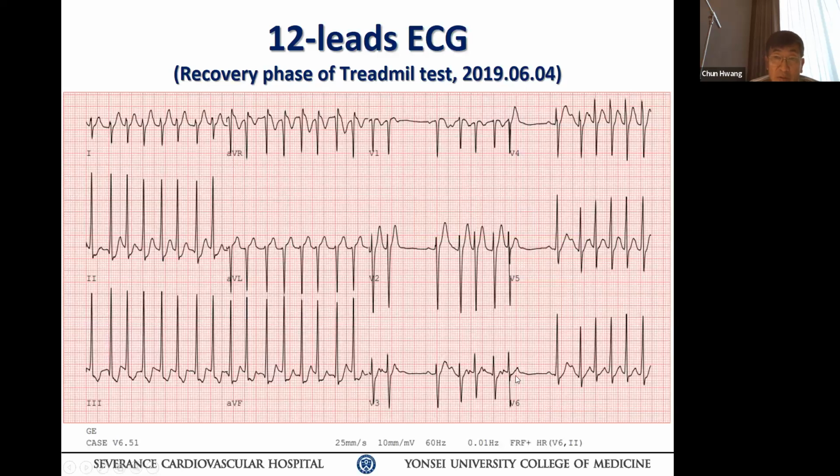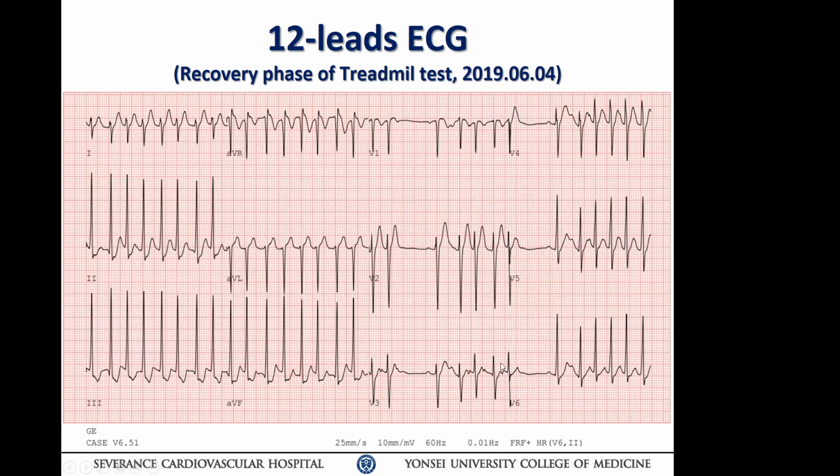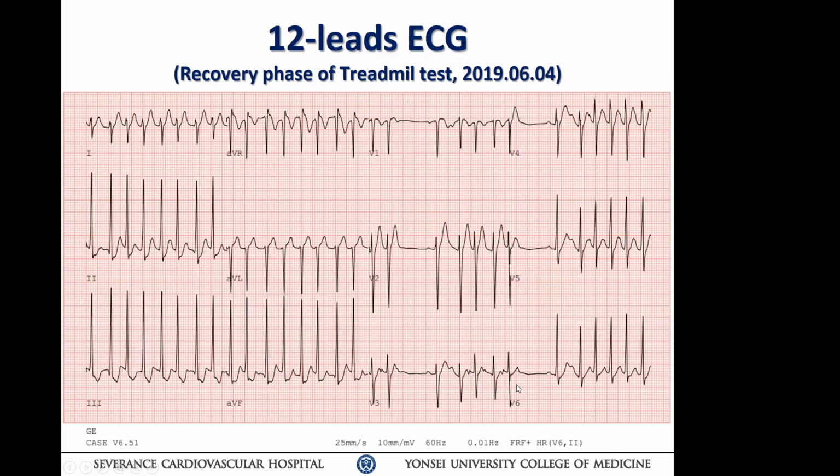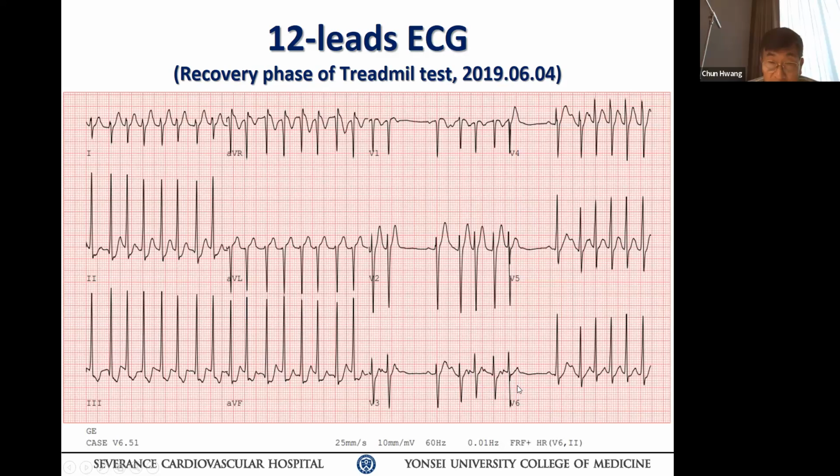So how many tachycardia mechanisms are you dealing with here? You may have a re-entrant tachycardia mechanism. You may have a focal mechanism here, right? Because you have an acceleration and an irregular RR interval. Look at this tachycardia: the RR interval at first, whatever re-entrant tachycardia, is very steady and regular. Suddenly it becomes irregular. After sinus, some sort of PAC and tachycardia. The RR interval keeps changing, almost alternating 2-to-1.